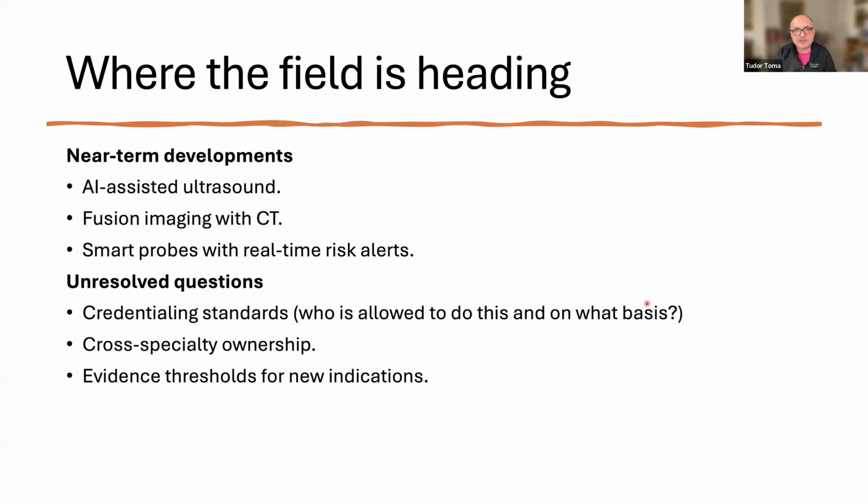My experience with AI-guided image acquisition is that it will not help you immediately, directly. It will tell you where you may improve, but then you still need to improve a little bit by yourself, if I may say so. So you need a bit of practice. It's not like transforming you into a robot and then you'll be able to do a perfect image acquisition because AI is telling you how to do it.